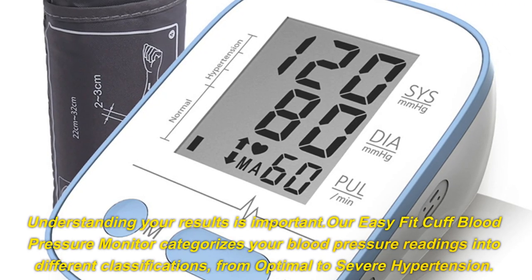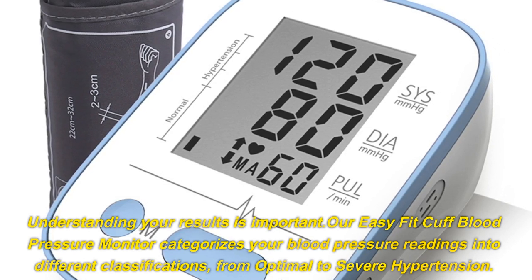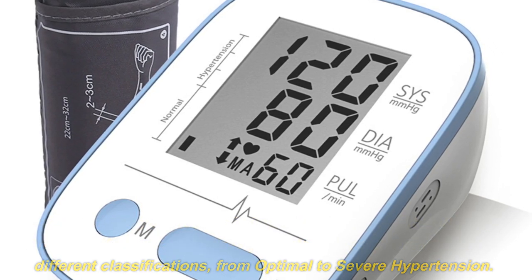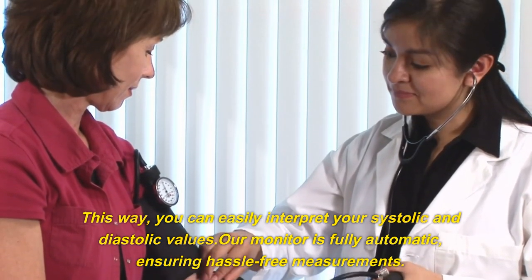Understanding your results is important. Our Easy Fit Cuff Blood Pressure Monitor categorizes your blood pressure readings into different classifications, from optimal to severe hypertension. This way, you can easily interpret your systolic and diastolic values.